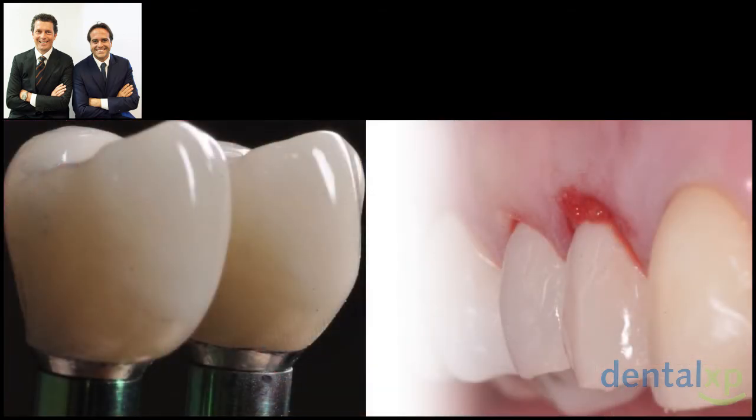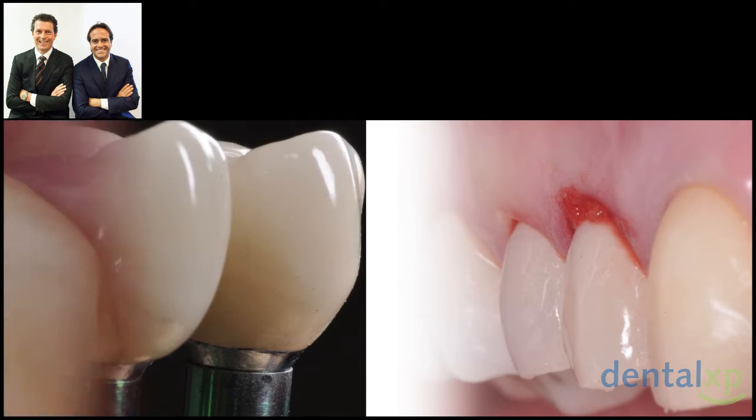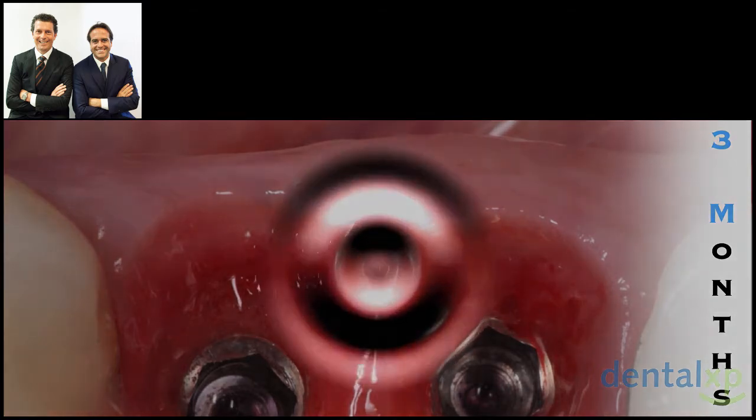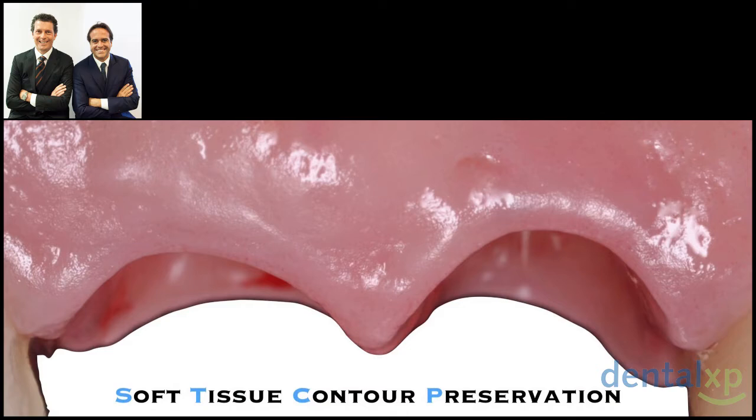In fact, thanks to the properly shaped provisional restoration, it has been possible to manage at best the soft tissue around. And we will see that managing the soft tissue is really the key, because the soft tissues are basically the frame of our final painting, which is our restoration. Look, in fact, at the situation at 3 months follow-up. Once the provisional restoration was unscrewed for the first time, here we have two implants next to each other, and look at the inter-implant papilla. We were able, thanks to the correct implant placement and to the proper provisional restoration management, to preserve this soft tissue all around the implants, and in this way maintain the overall aesthetic of the restoration.